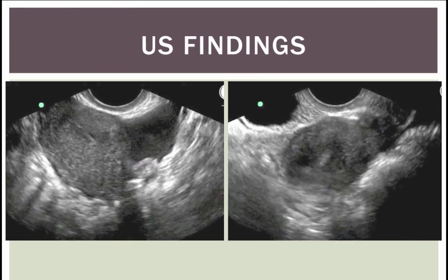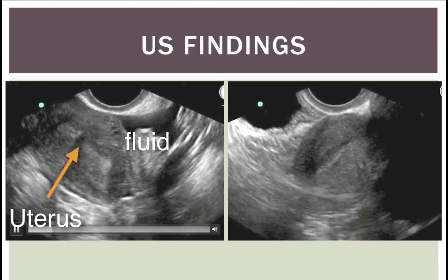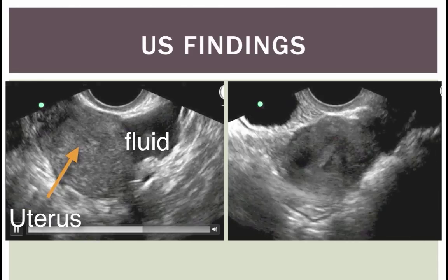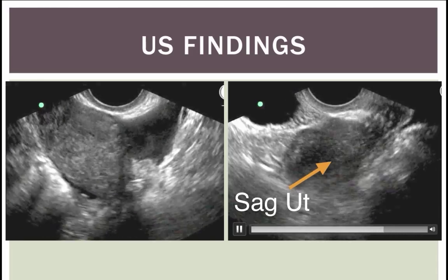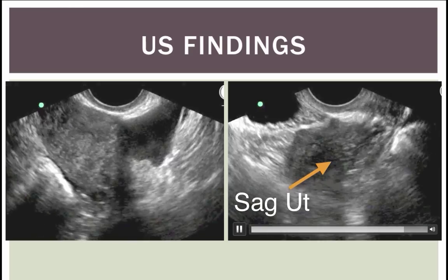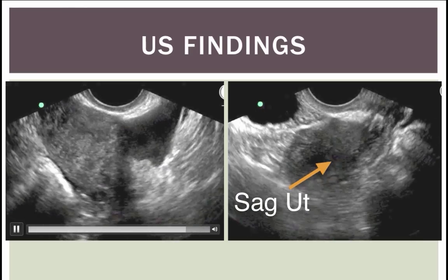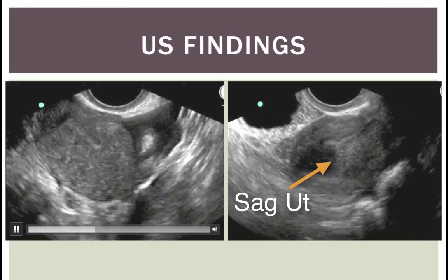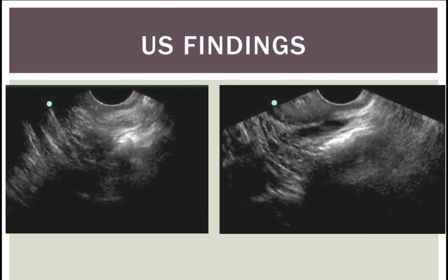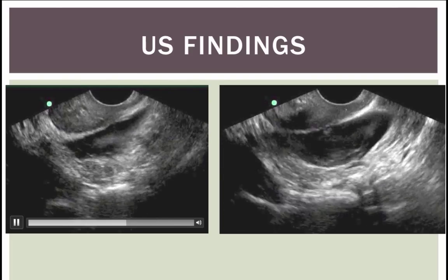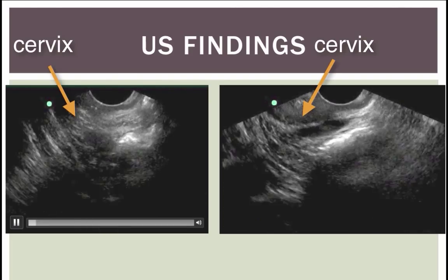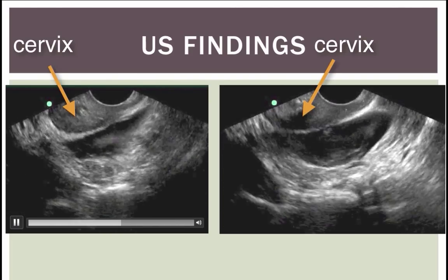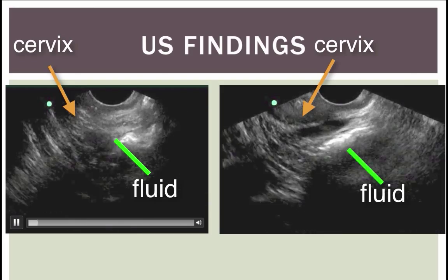Now we're on to transvaginal findings. We see the uterus, we see free fluid here. There's a sagittal view of the uterus - we certainly don't see an intrauterine pregnancy. The endometrial stripe looks thin, there's nothing in there. But we do see some - we're close to the cervix - we see some free fluid here and it has some echoes in it. There's gray stuff floating in there.